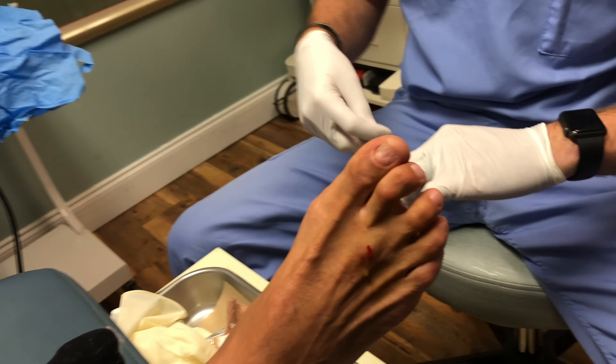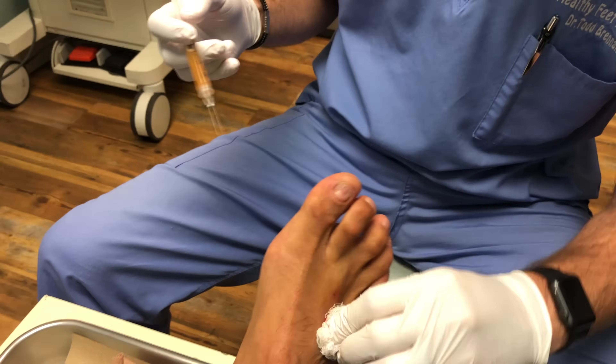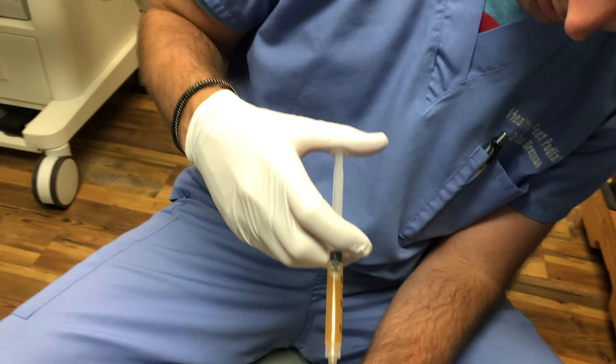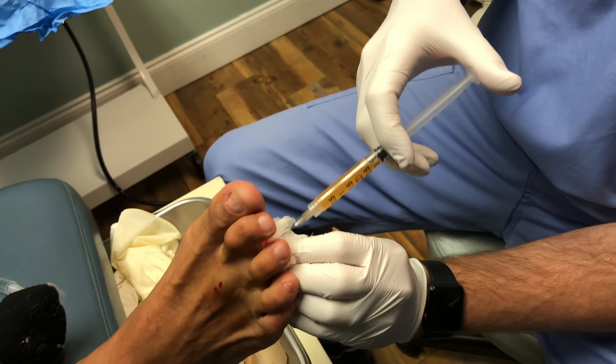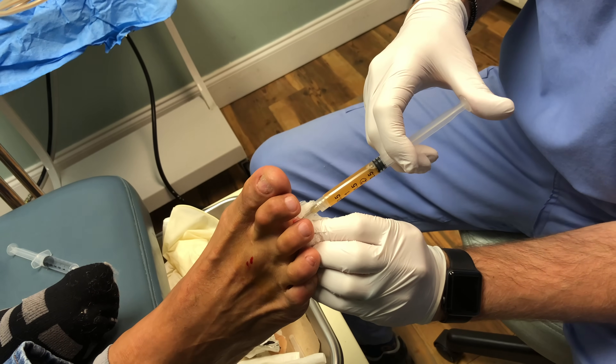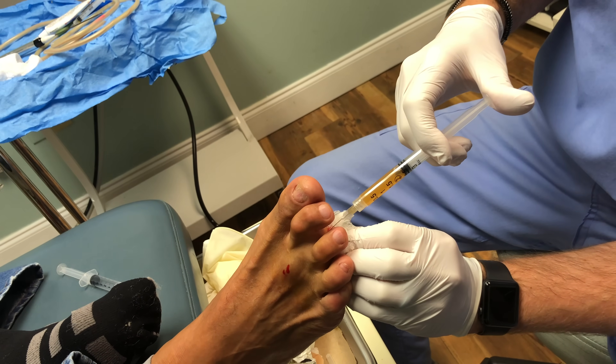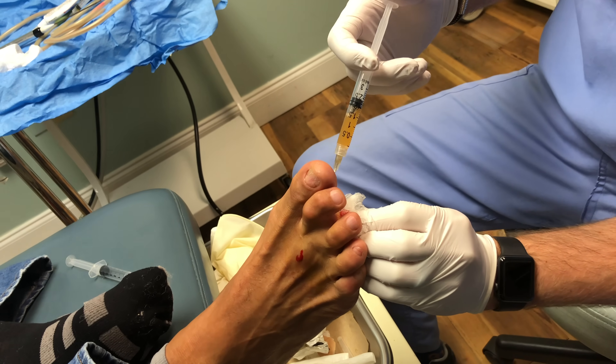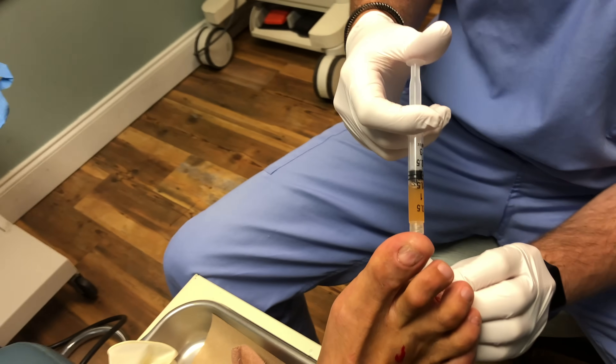The second one I'm going to go between the toes again, so it's just a different plane. Obviously I cover up the previous little incision so it doesn't squirt out. Just pepper that area in there a little bit. If we did this without anesthetic, he probably would have wanted to kick me in the face by now.